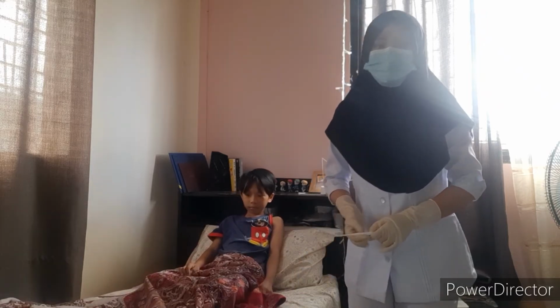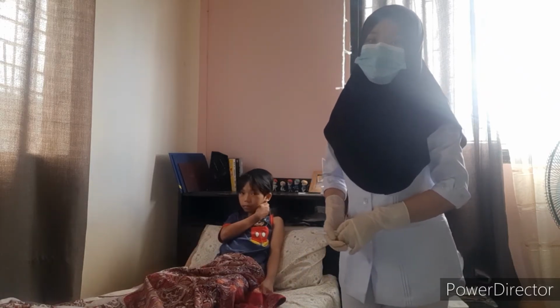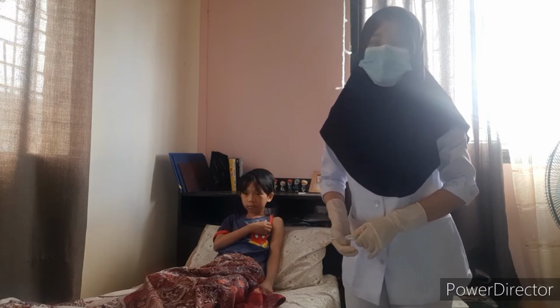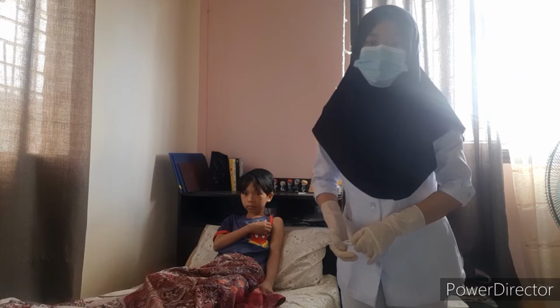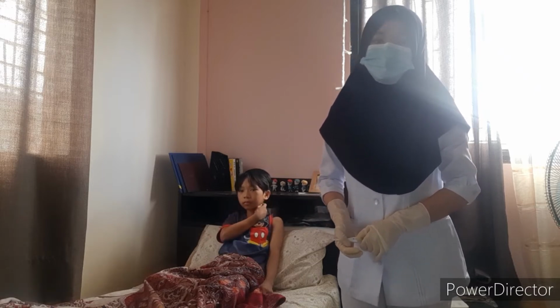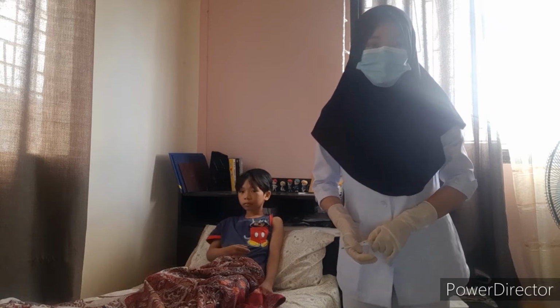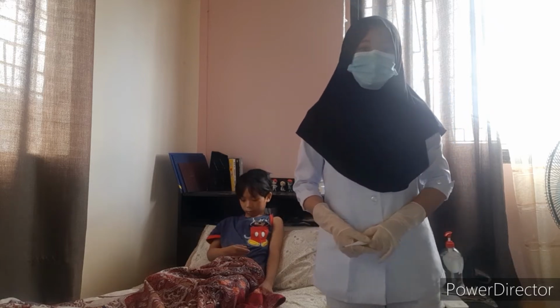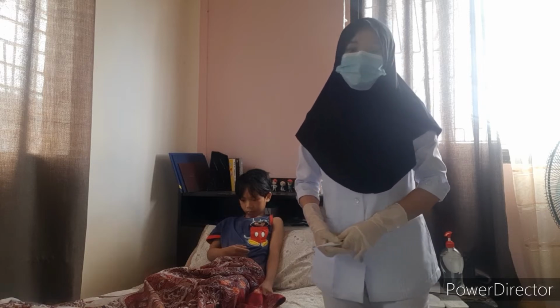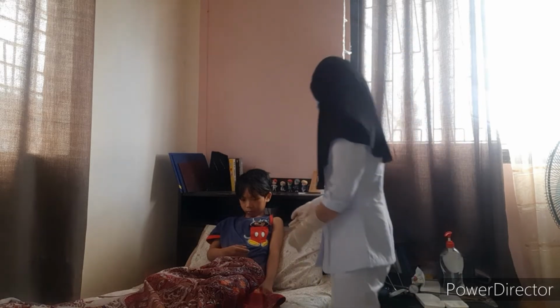So after putting on a probe cover, cover the tip of the digital thermometer. Place the probe into the center of the axilla by pointing upward towards the head. So fold the client's arm downward and place the arm across the client's chest so the body heat is trapped. So this is to maintain the proper position of the thermometer bulb against the blood vessels in the axilla.